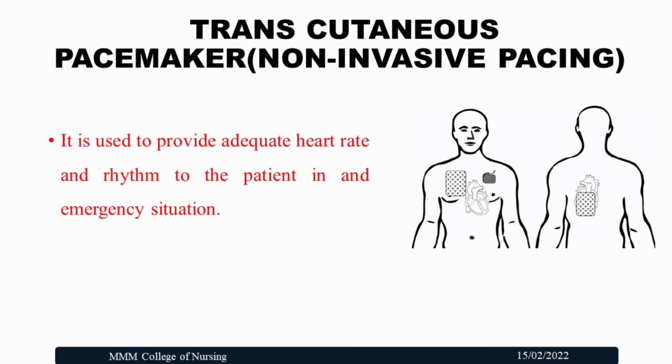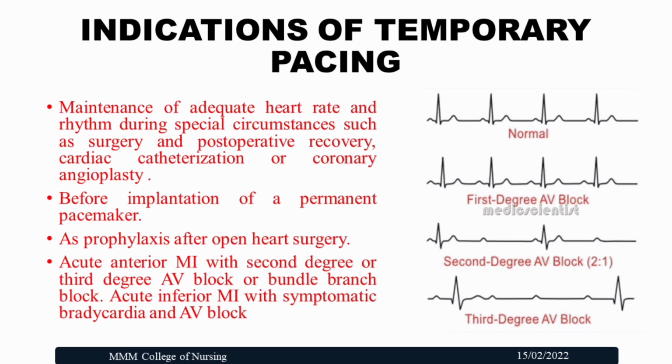Third one is the transcutaneous pacemaker, which is the non-invasive pacing method. It is used to provide adequate heart rate and rhythm to the patient in an emergency situation.